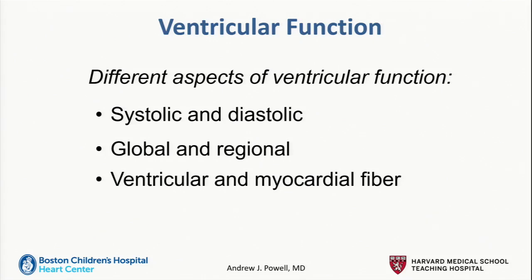And then another dimension to think about function is, are you looking at it at the ventricular level, or are you looking at it at the myocardial fiber level? So ventricular, again, thinks of it as kind of one unit, one pump, and the fiber level looks at it as individual kind of shortening, force-generating units.